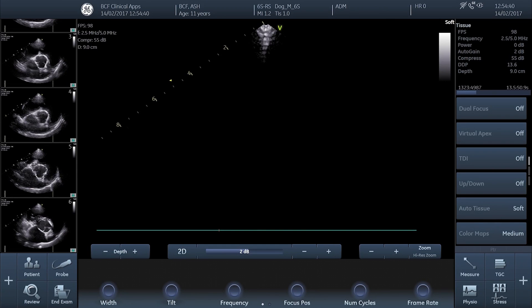Hello and welcome to the third and final video in our cardiac measurement series. We're going to look at assessing ventricular systolic function by calculating the ejection fraction using a measurement package on the ultrasound machine. The specific method we're going to look at uses what is known as the modified Simpson's rule, or method of discs.